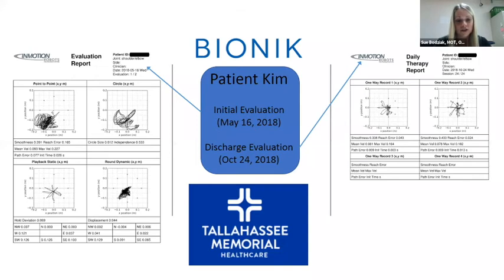So for her to visually be able to see that she can just make movement on the screen, even though it's not a perfect circle or a star shape that she's expecting, she still was just happy to be able to move. And then when you explain to her the results, it's really motivating as well. And also the carryover of her feeding herself and driving her wheelchair. Yeah. That's just another level of independence for someone who was told they would not be able to do anything. That's amazing. Right. Sheree, I'll let you jump in now.